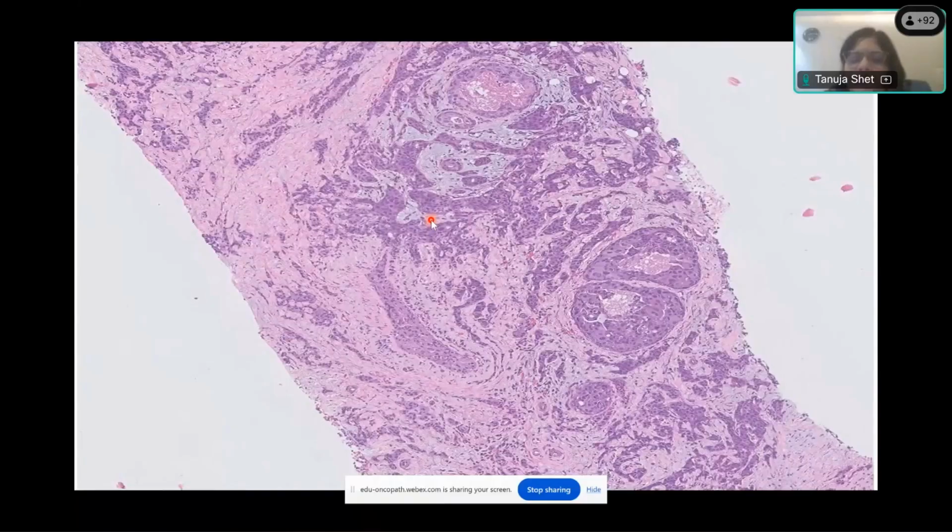And there is the next one. I should have given you a higher power, but I haven't given you that. So that's okay, sorry. So DCIS and LVI are some of the things that we mention in a report, because something called HDR, or high dose radiation, or brachytherapy, is done for operable breast cancers. And for that, we need to know.